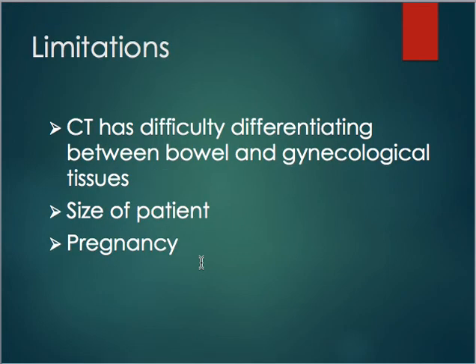CT does have some limitations. Remember, I said that it's pretty much good at visualizing everything. The difference is there is some difficulty differentiating between bowel and gynecological tissue on CT. That is the biggest limitation. The other issues could be if the patient is pregnant. We don't want to scan a patient if they're pregnant unless it's a very high-risk situation where we do not have any other options. And also the limitation would be the size of the patient.